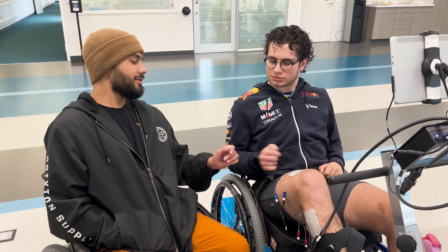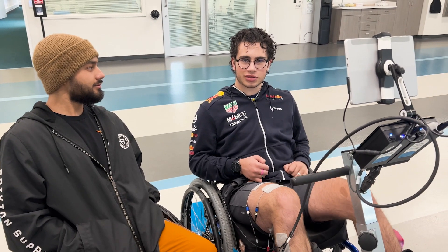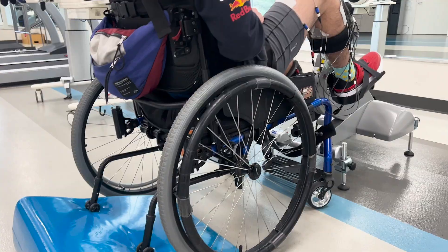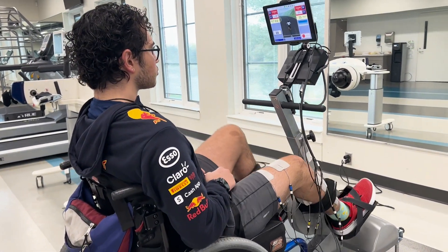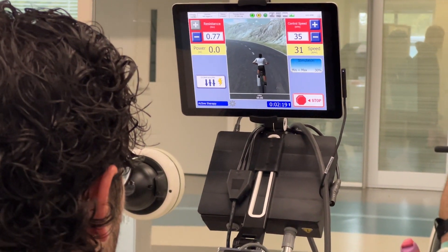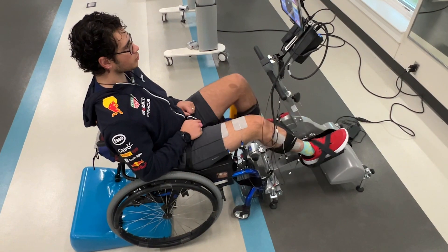Hey, we're here with my buddy Pata and he's on the FES. Right now I'm doing lower extremity functional electrical stimulation, and depending on where my leg is in the movement, certain electrodes go off to make my muscles fire. It promotes motor function recovery and helps me reduce spasticity.